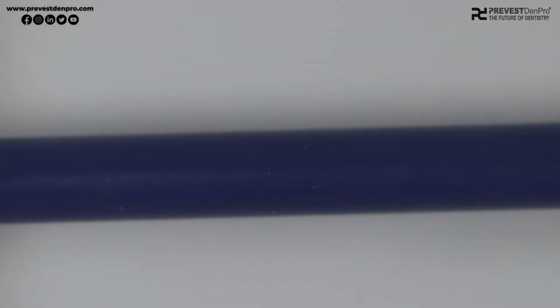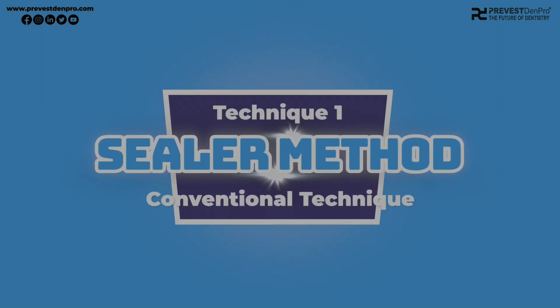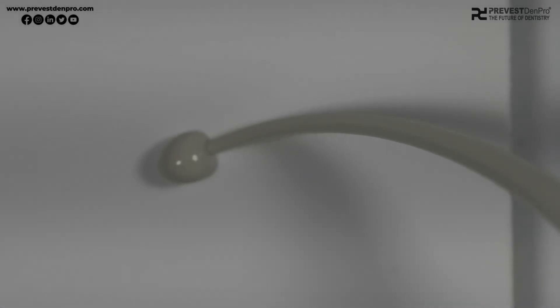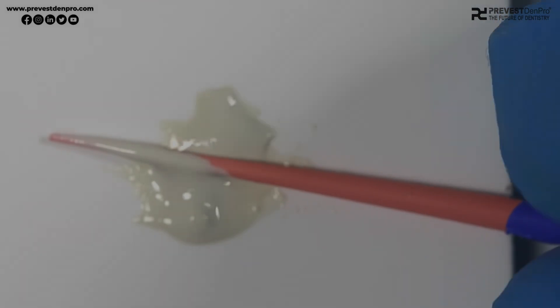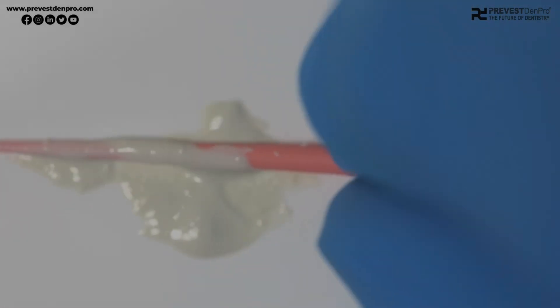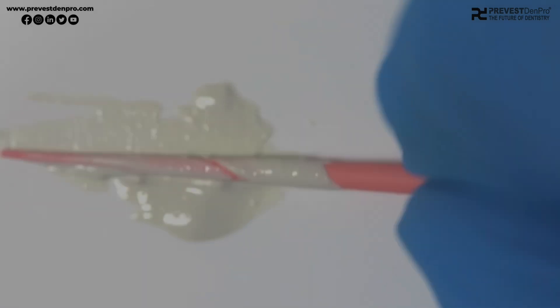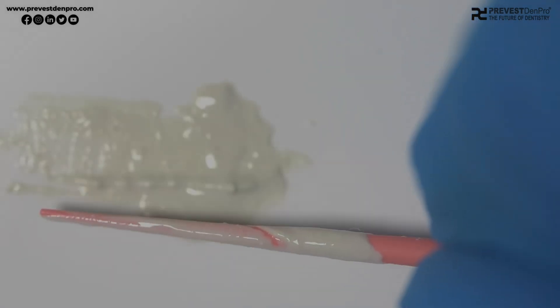There are two methods or techniques for using Seraphil RCS. The first is using it as a conventional sealer, where we dispense the Seraphil RCS onto a paper pad, take our master cone for the prepared canals, and coat the master cone with the Seraphil RCS. We coat the canal walls and simultaneously obturate the canals with the help of master cones.